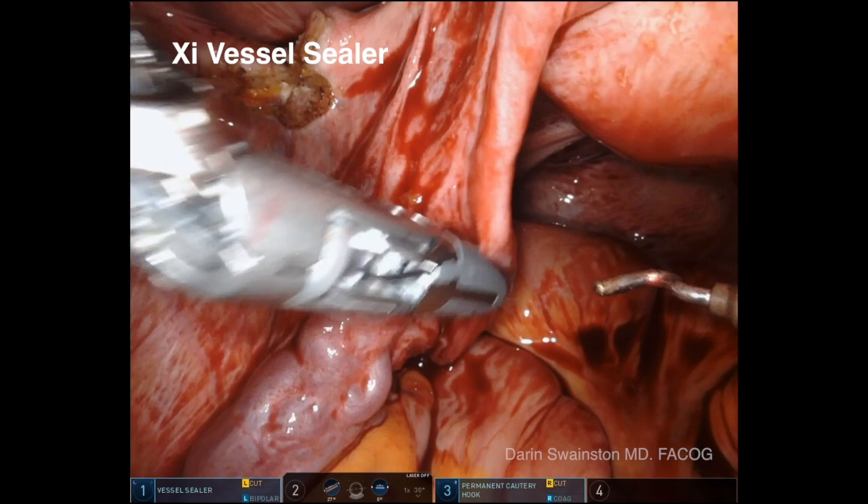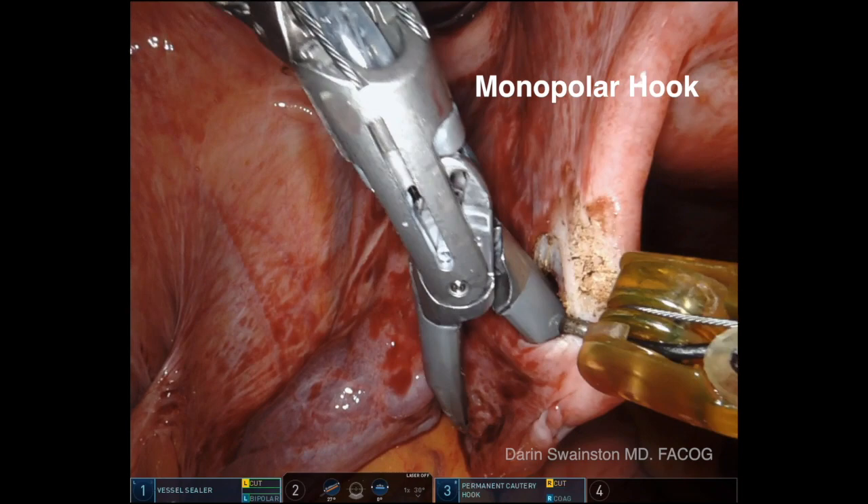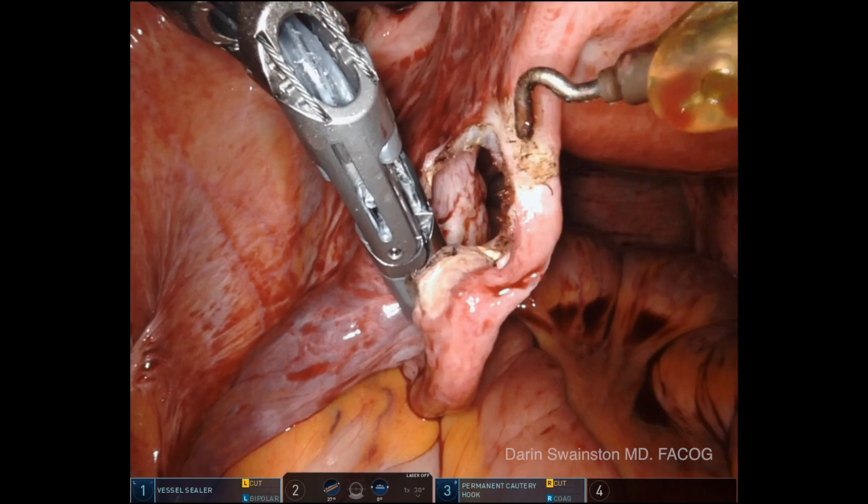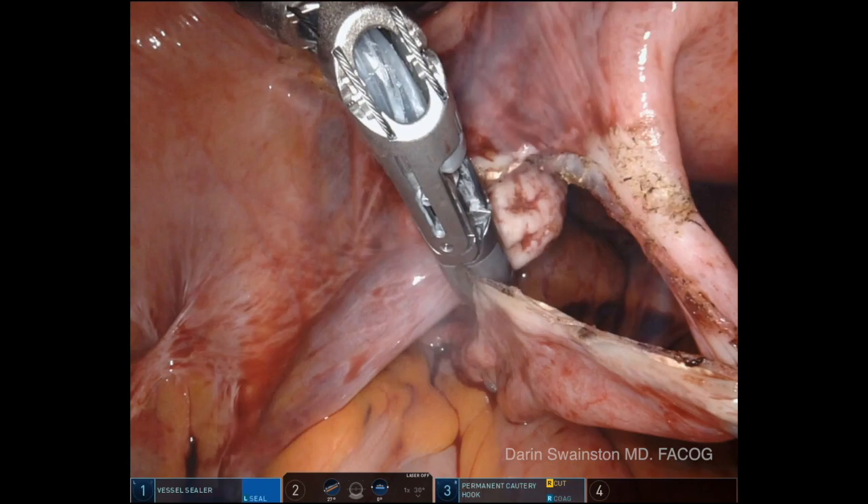This is using the monopolar hook in combination with the vessel sealer, which creates the least amount of thermal spread to the normal tissues — thought to be one to two millimeters wide of thermal artifact. You can really see in this example just how minimal thermal artifact there is.